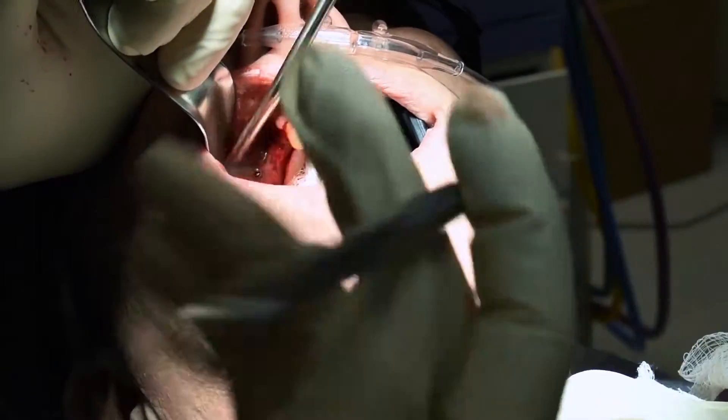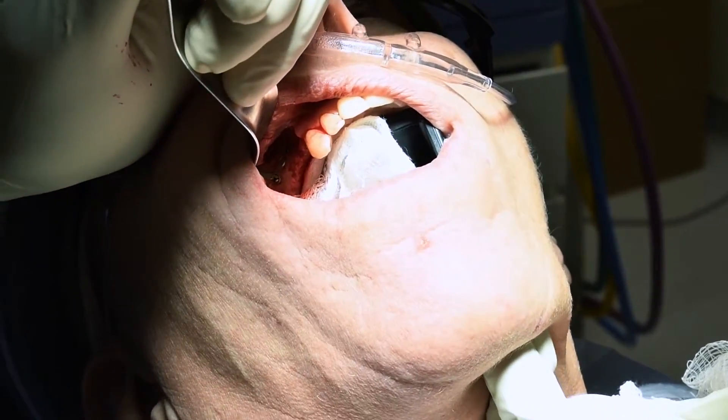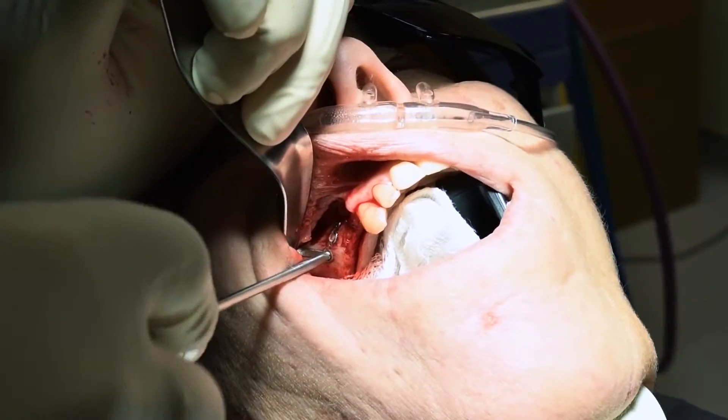I think what we'll do — I think I've got these two screws — I'm going to section the plate and then leave the rest of that up high. It'll be easier in the end. Let me have a screwdriver. 703. Got it.